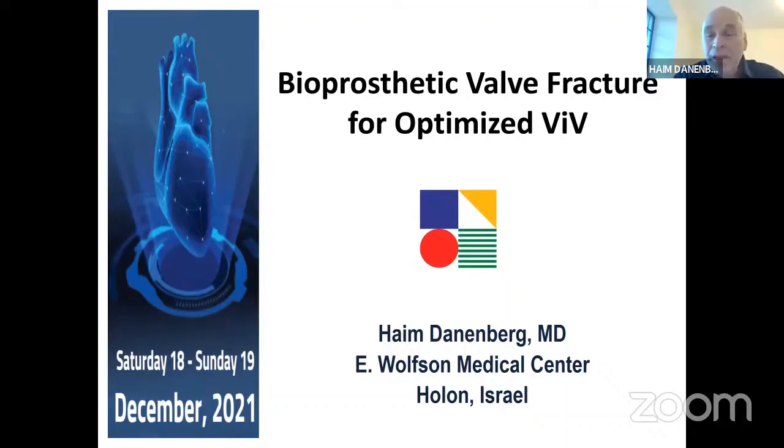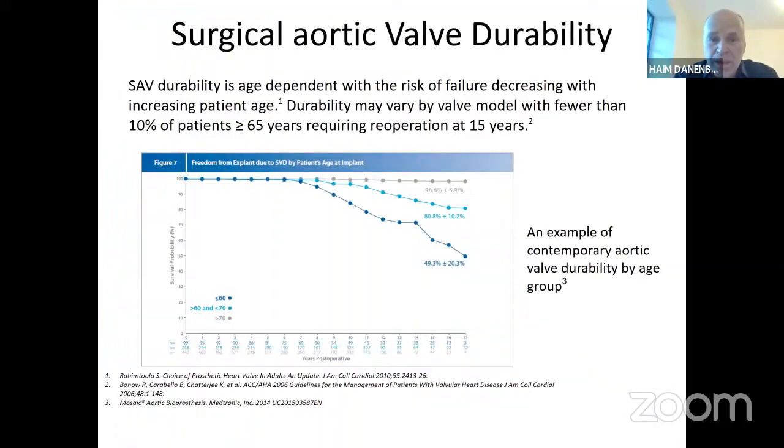I would like to discuss in short the issue of bioprosthetic valve fracture for optimized valve-in-valve procedure. And it's a wonderful opportunity to speak after Dr. Parikh, who spoke about patient prosthesis mismatch and the issues of small valve, which is actually the harbinger for doing the procedures I will discuss in short now.